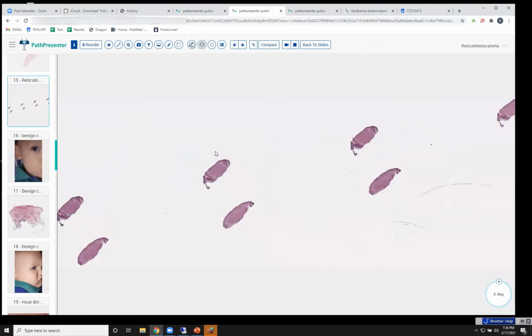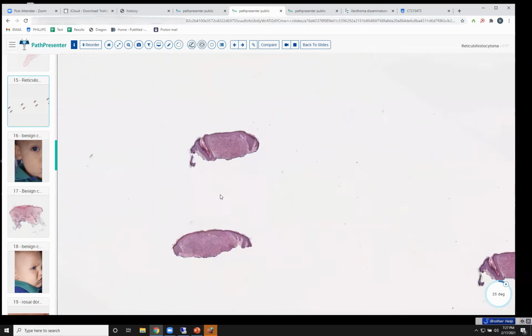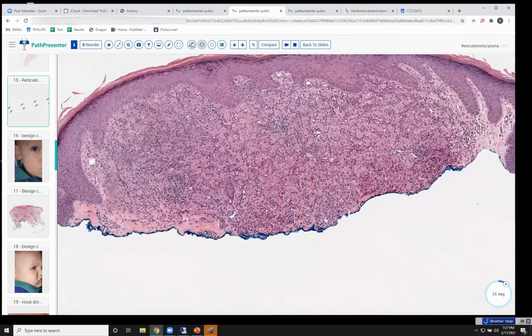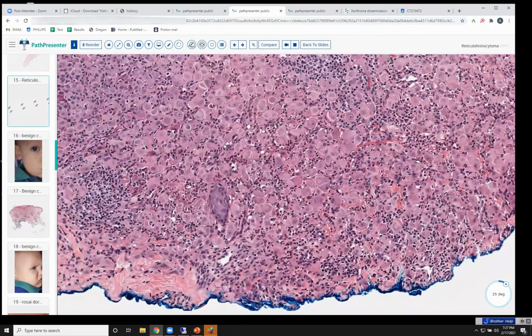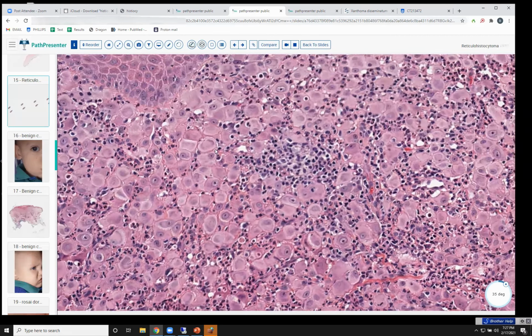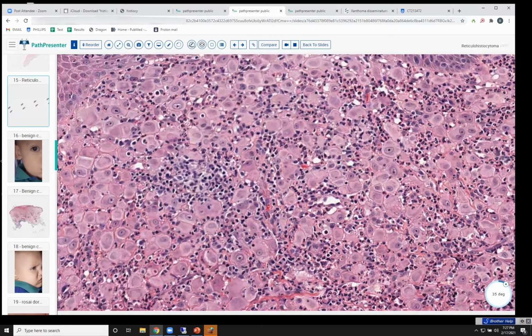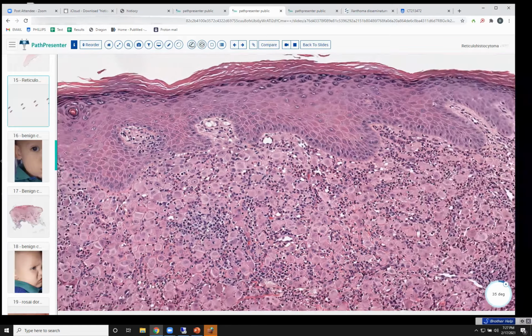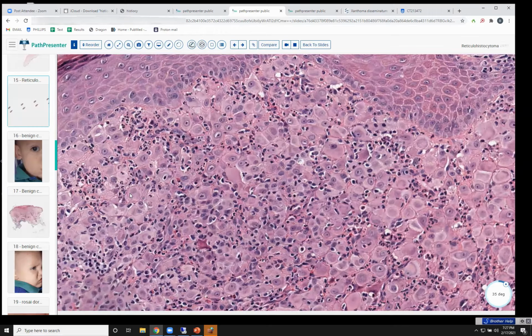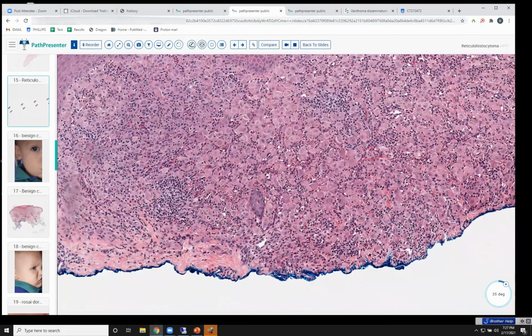And this I'm just putting here because this turned out to be a patient with multicentric reticular histiocytosis who had arthritis. And again, here you can see they're exactly these same kind of ground glass mononuclear cells with a distinct nucleolus. Some of them have got some foaminess and some eosinophils, and a few neutrophils even in the infiltrate here. So you really need the clinical to distinguish these.